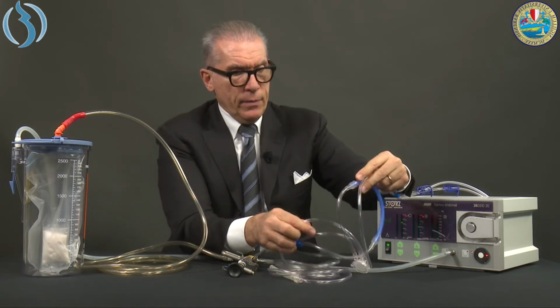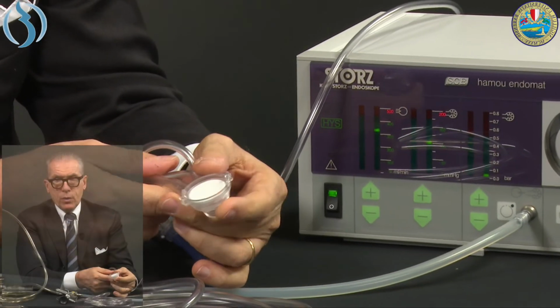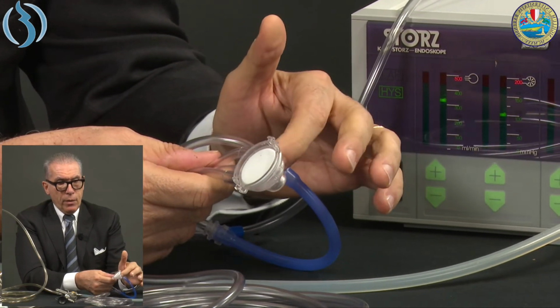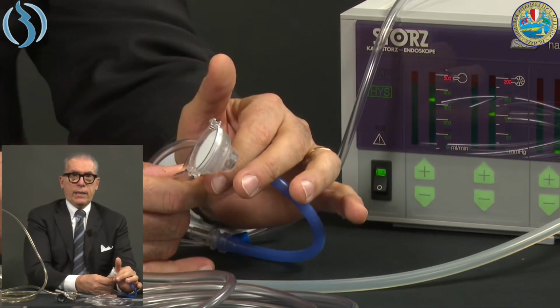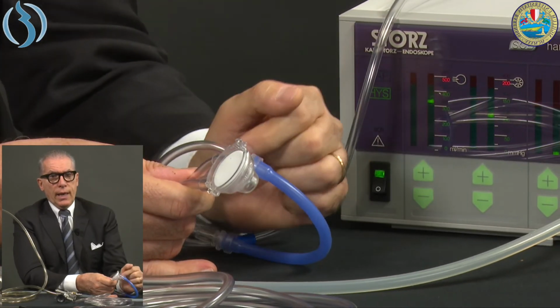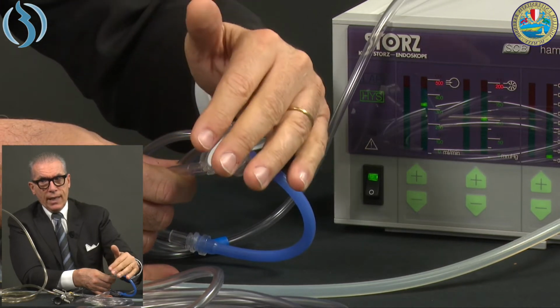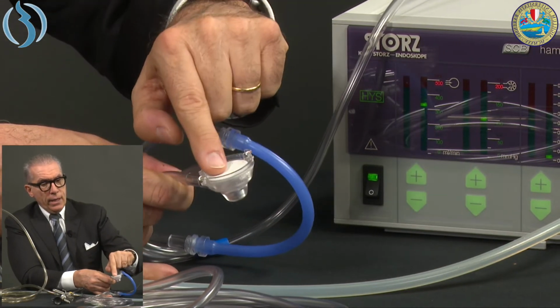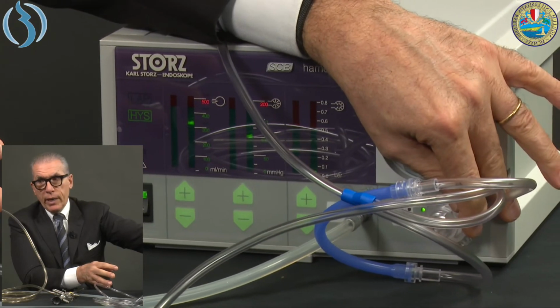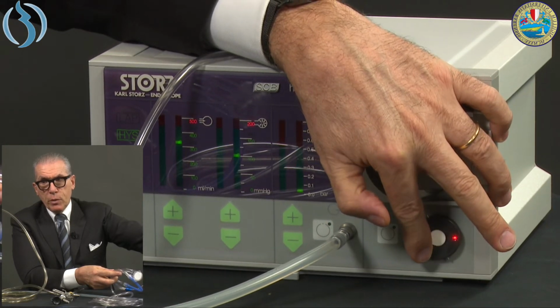Then you have this intermediate part, where you have the sensor for the pressure, or the membrane for the pressure. This soft membrane here, if the resistance of the fluid is the one calculated by the technician originally, nothing will happen. But if the resistance increases, it means we reach a certain pressure at the end of the system, at the tip of the scope, and this membrane will increase in size and will be like a dome. And because the sensor is applied here on the membrane, the dome of the membrane will touch the white part of the sensor. And look what's happening if I touch it with my finger.